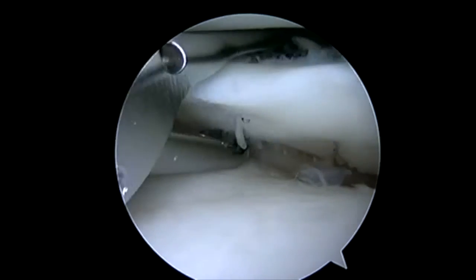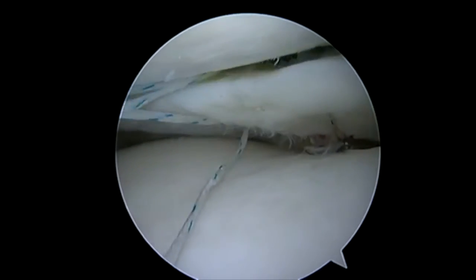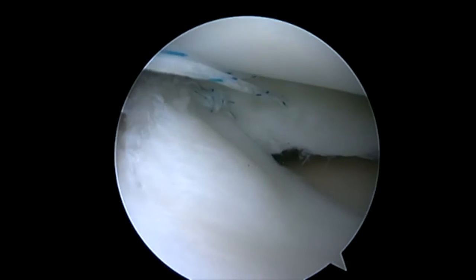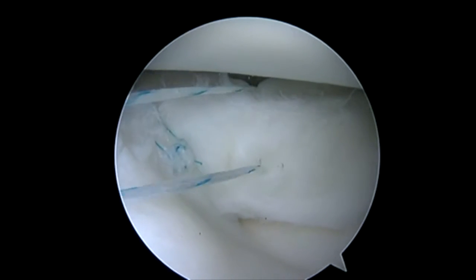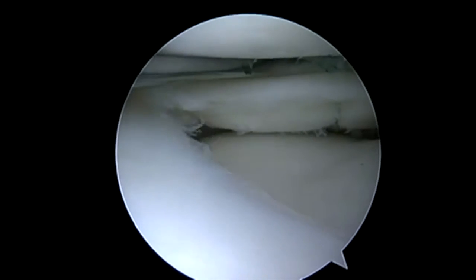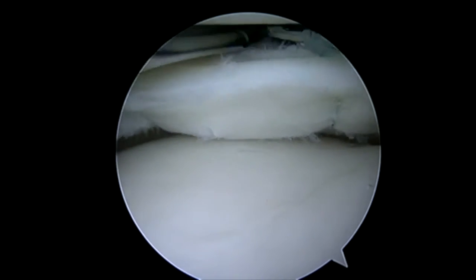In this device, the sutures are preloaded onto two needles so I can pass both of them. They'll get caught in the upper jaw, and I'm able to pull the sutures out of the joint and pull a loop underneath. I've passed another suture here, right at a spot called the popliteal hiatus — a spot where the tendon runs directly behind the meniscus and is not attached. I want to make sure that I didn't sew into the popliteal tendon itself, and we're successful in checking by pulling out that we did not.